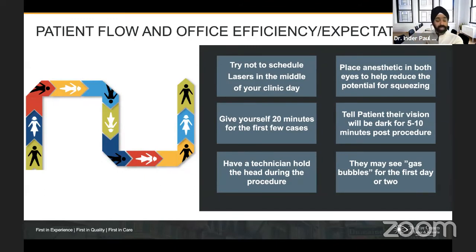And I don't give them any post-op drops. I will say though, check their pressure. For the first few sessions, try to check the pressure within a couple of weeks, especially if it's a post-YAG capsulotomy patient with an amorphous cloud, because I have seen very rarely patients come back with pressure spikes. So if there's a glaucoma patient, I'll check them within a week or 2 to make sure that the pressures are okay, and I'll keep them on anti-glaucoma meds. If they have a risk of glaucoma or risk of ocular hypertension, I'll put them on a topical drop like a Timolol or a Combigan or Cosopt or whatever those drops, just to keep them until I see them next time. Again, very rare, but that is the one adverse event that I have seen once in a while that I want to make sure that you're all aware of that can happen.